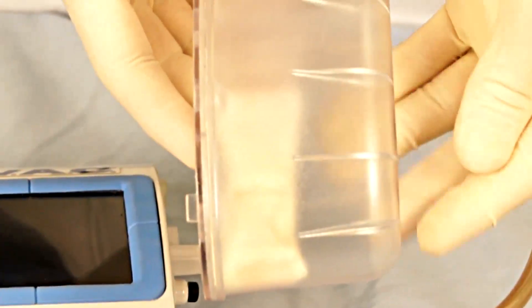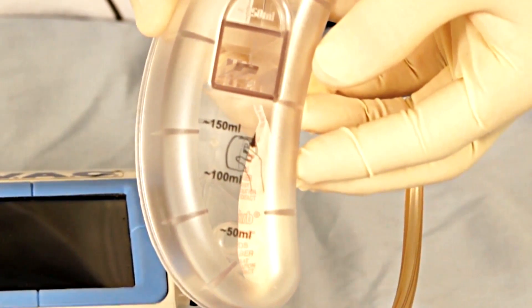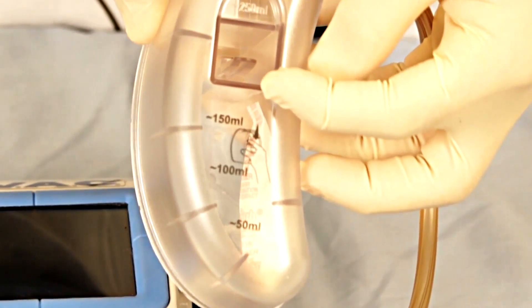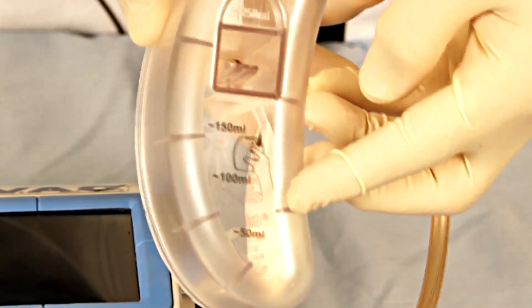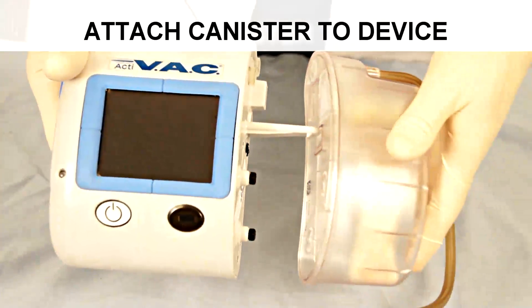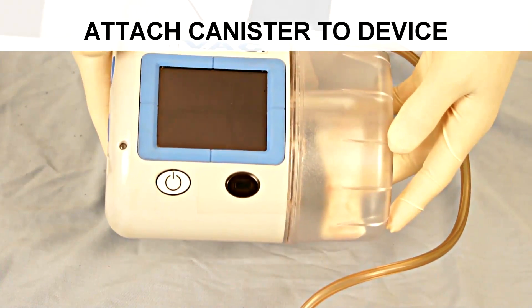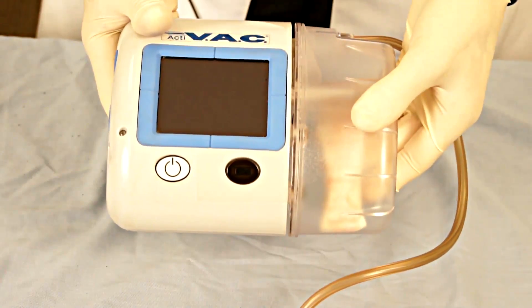This canister is supplied with a chemical absorbent that absorbs the fluid, as well as graduated markings that measure the volume of fluid removed from the wound. One would take the generator device and attach the suction canister to it until there is an audible click and the canister is adhered to the machine.